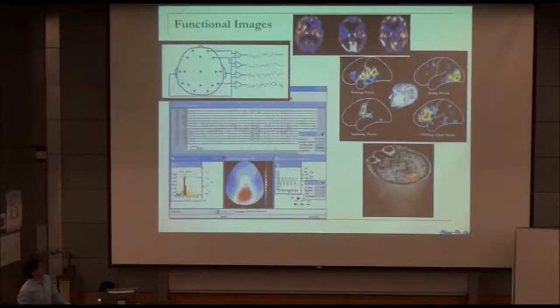And here is the PET result. It has a very good benefit: we can detect a specific metabolic source, for example, glucose and so on. And here is functional MRI. Later, I will focus more on functional MRI, because that is the technique we use very easily nowadays, and it can detect a lot of information.